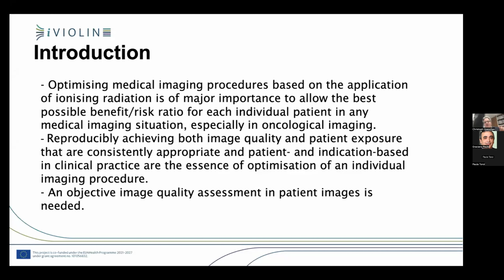With reproducibility, we mean that this should be the same everywhere you do such imaging for the purpose of diagnosing or staging or whatsoever. This is the essence of optimization of an individual imaging procedure. So we need some kind of objective image quality assessment in patient images.